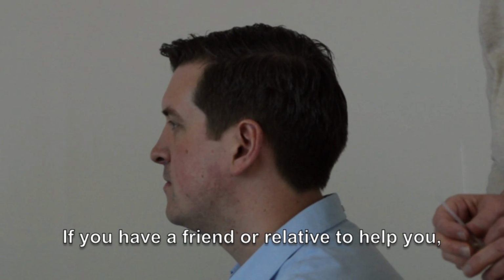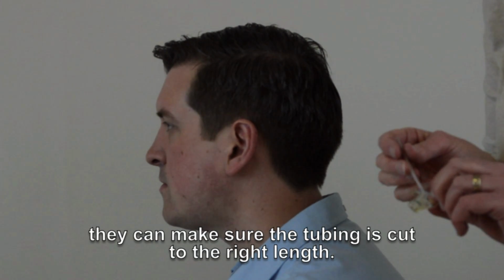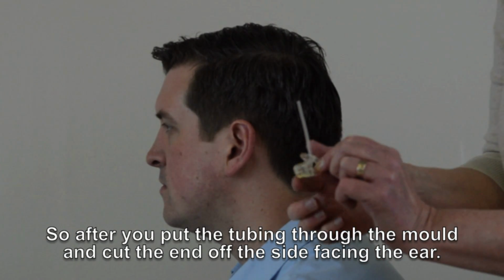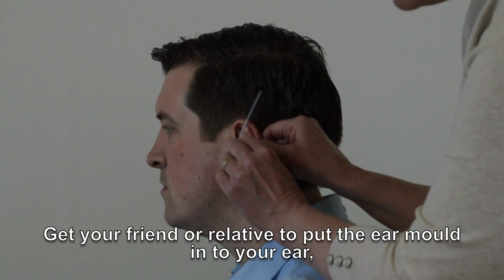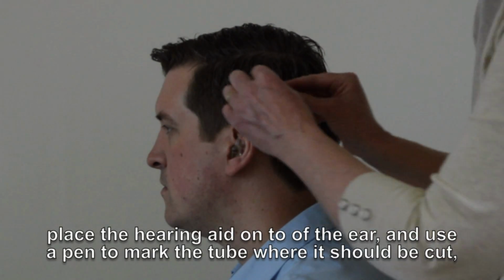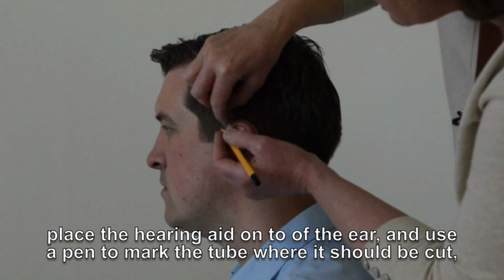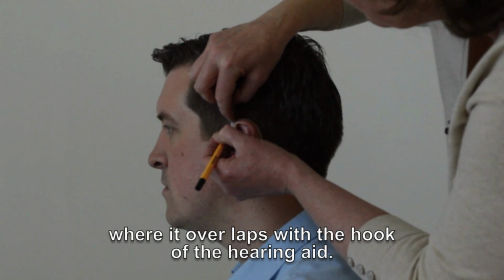If you have a friend or relative to help you, they can always make sure that you get the tubing cut to the right length. So after you put the tubing through the ear mould and cut the end off on the side facing the ear, your friend or relative will put the ear mould into your ear. They'll place the hearing aid on top of the ear and use a pen just to mark the tubing to be cut where it overlaps the hook of the hearing aid.